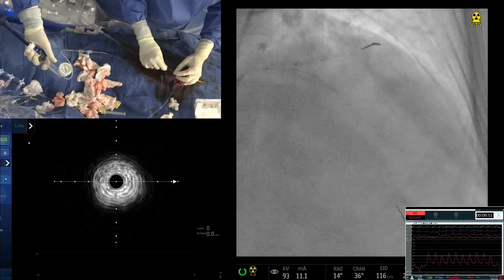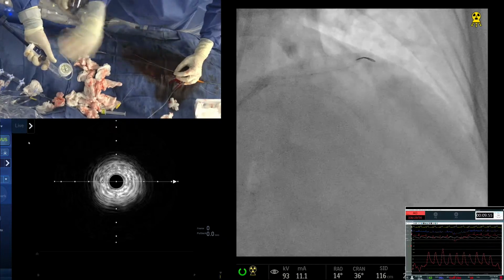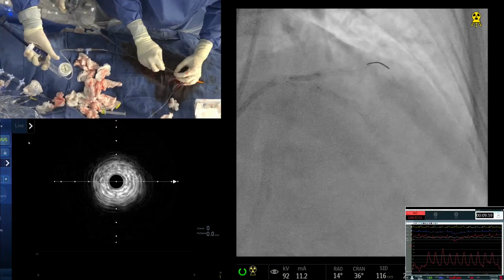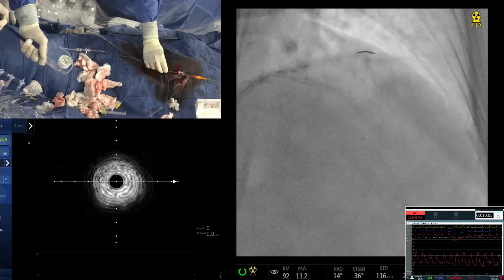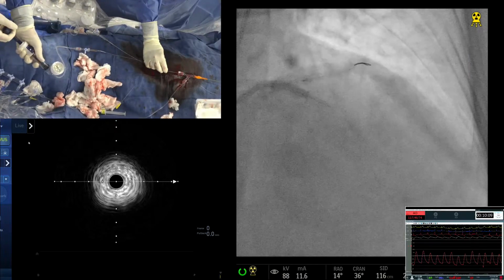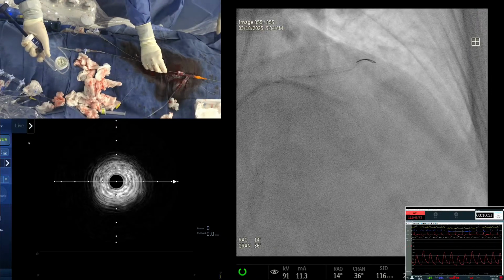Yeah, enough. Okay. They don't come left main. We have done everything. Okay, good. No, but I want to open the side completely nicely. So if you have done that, you're going to a different cell, that is done. And if you are having issues crossing, that's the time you will know that you will need a smaller balloon to recross into the side branch.